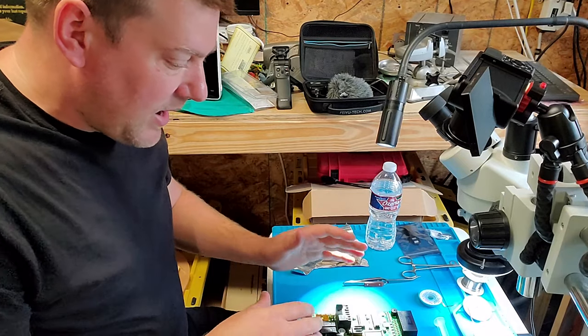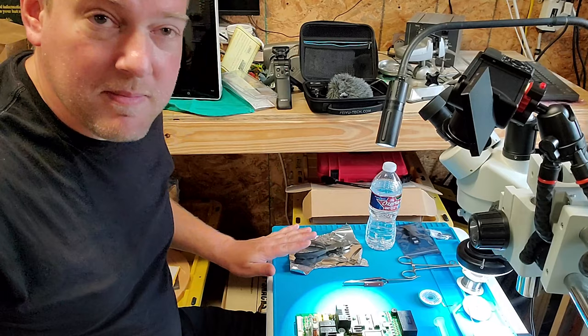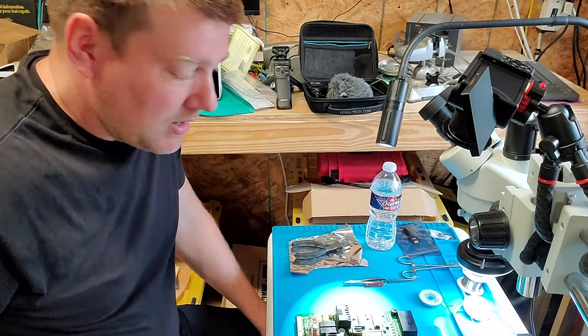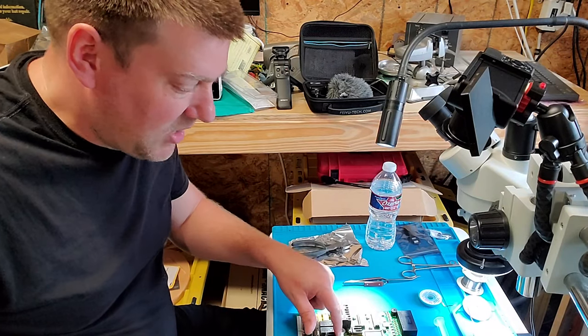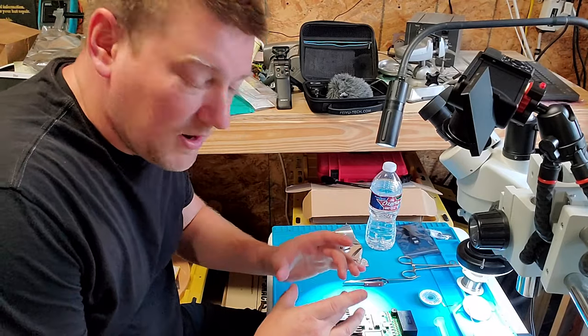I'm going to go ahead and apply some heat masking. I'm going to do that with some aluminum foil. Sometimes people use Kapton tape, which is the yellowish tape. I'm going to use aluminum foil because I want a little bit of extra protection against things like the plastic components of this Omron relay right here. But also, I want to keep that heat very localized.